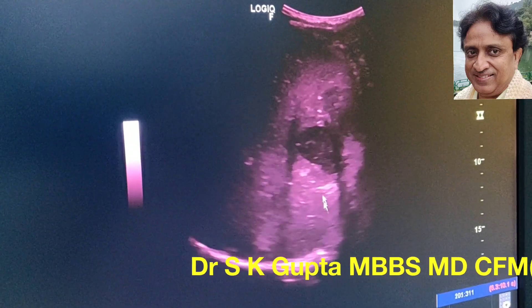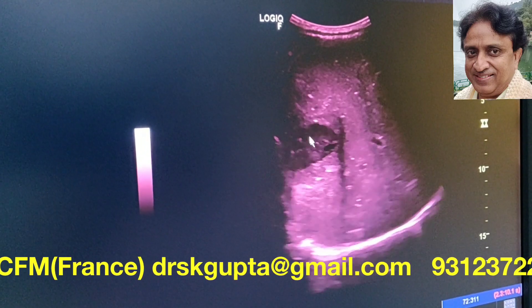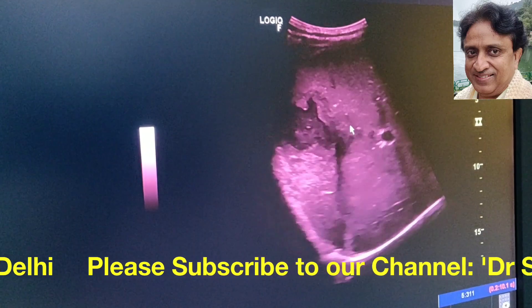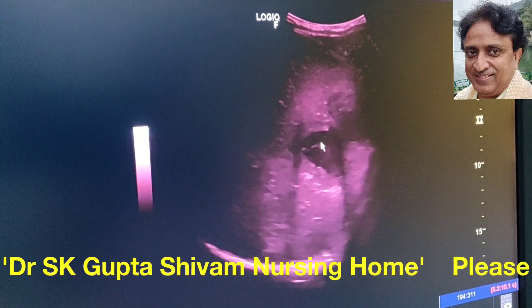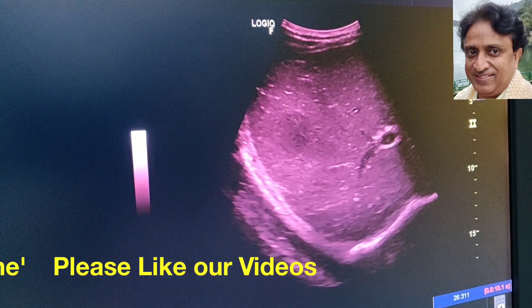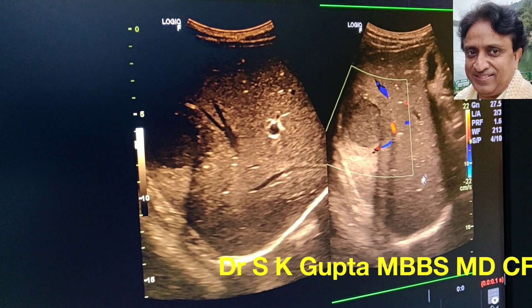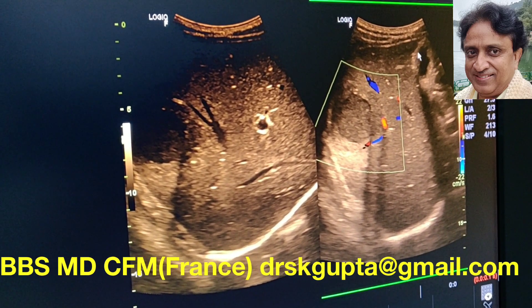This is another case of liver abscess — you can see two abscesses joined together, appearing to merge. This is a solid abscess, not yet liquefied — the patient has come early in the course of disease. As the liver abscess liquefies, it will become more clearly defined. The gallbladder walls are thickened, which suggests this is a fresh abscess with evidence of ongoing hepatitis.